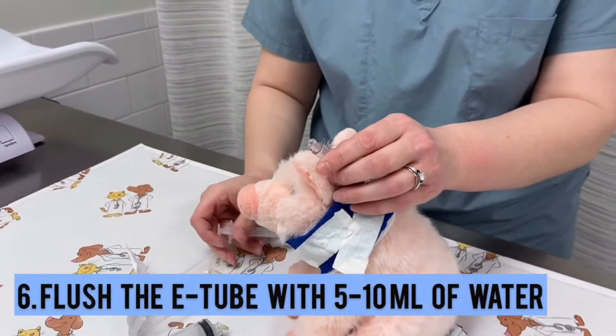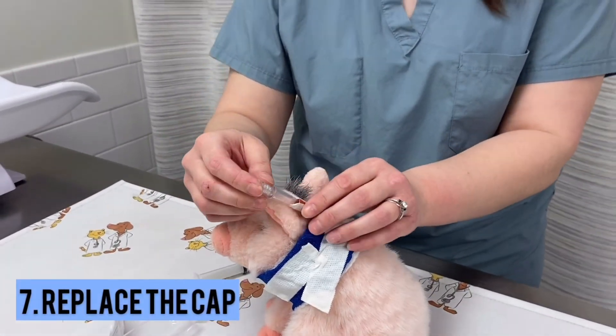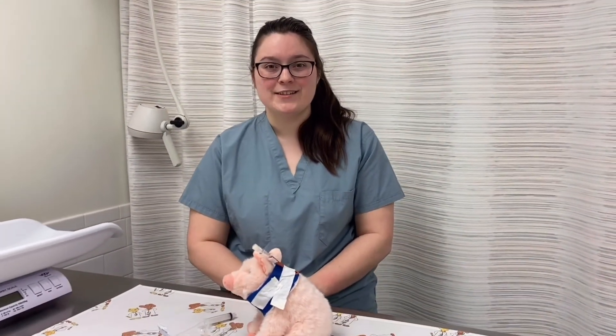After every feeding and after all medications, you're going to want to give a certain amount of water — usually we recommend 5 to 10 mils, but that will be specified on your discharge paperwork. And that was how you feed your pet through the tube.